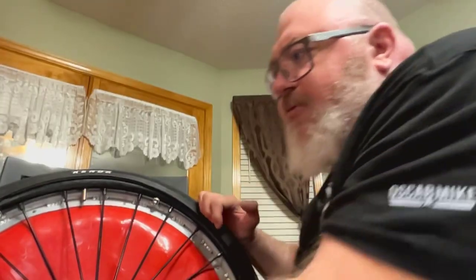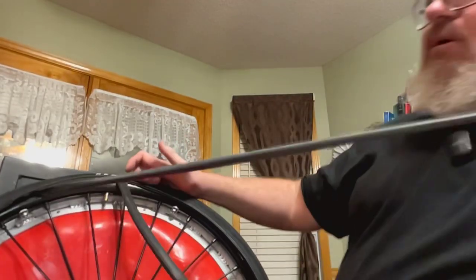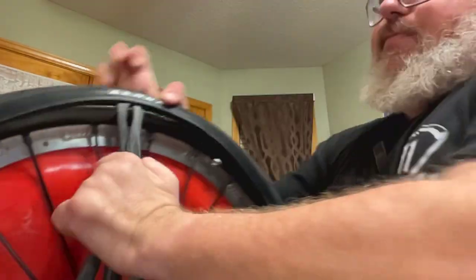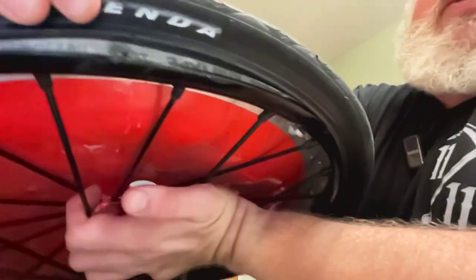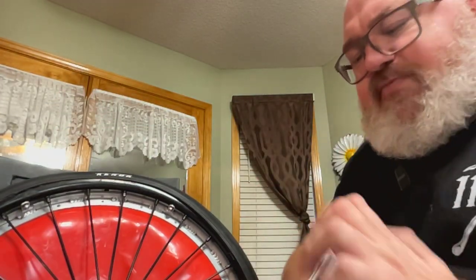I am a quadriplegic, so I hold it like this, like I'm stabbing someone. Obviously, I like stabbing people, as you found out from yesterday's video. So, tube comes out. Voila! Pull it, get a little bit of tension on it, pull it up. So I pull this part like that, and just pull the tire out. That little trick, just pulling it back and letting the rest of the tire fall in, is kind of a cool thing when I'm putting the tire back in.